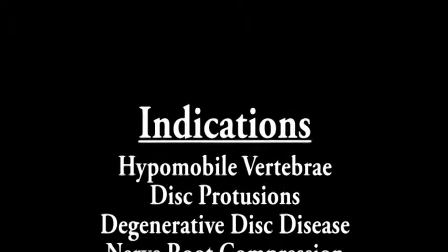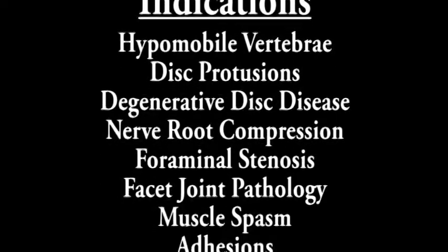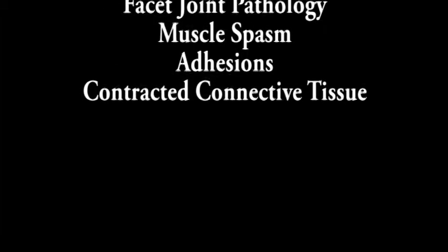This podcast is for the lumbar traction modality. Before this modality is applied, the clinician must check for indications and contraindications. The indications for traction include hypomobile vertebrae, disc protrusions, degenerative disc disease, nerve root compression, foraminal stenosis, facet joint pathology, muscle spasm, adhesions, and contracted connective tissue.